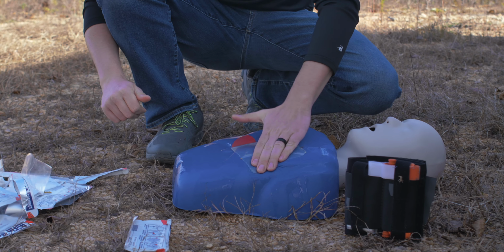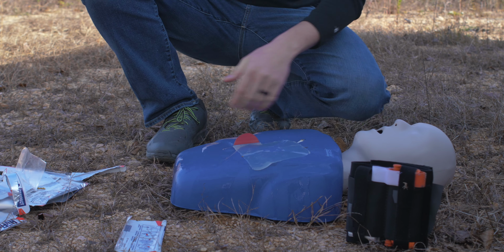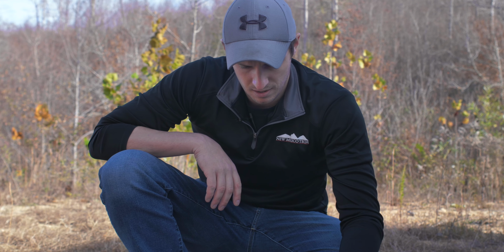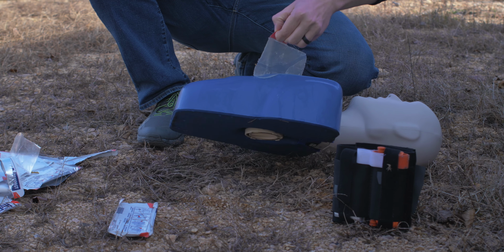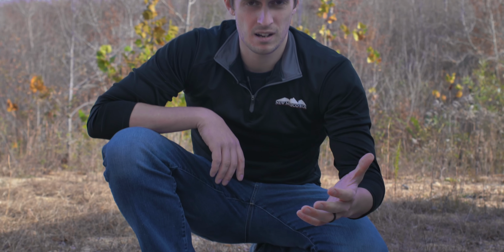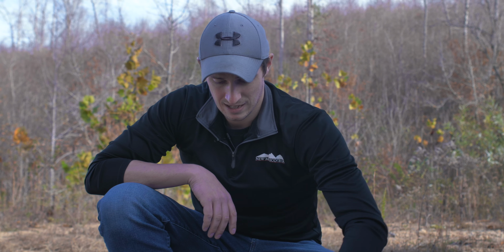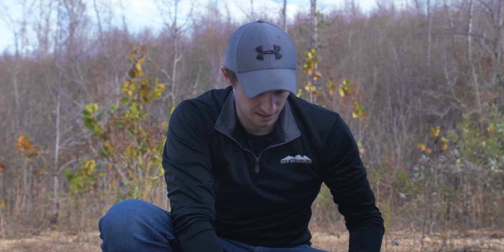All right, so this with no drying, just dropped it on the mannequin, pushing it on there. Now it appears to be sticking, and I think this one-way valve would work to allow air to escape. I mean, it's sticking fairly well, enough for me to pick the mannequin up by it. So it's not perfect. I would still like to dry that with that 4x4 beforehand, but slapping it on completely wet, it's still enough to hold the mannequin by. So that's still pretty sticky.